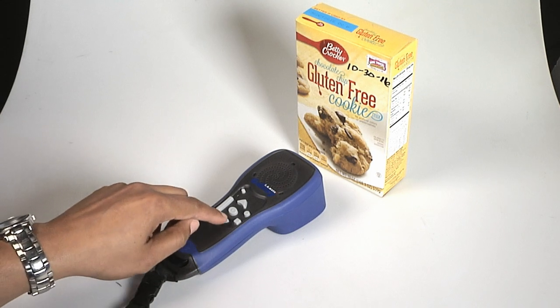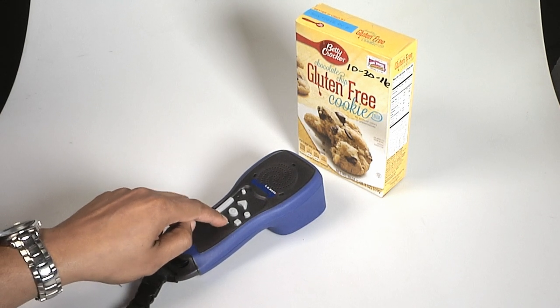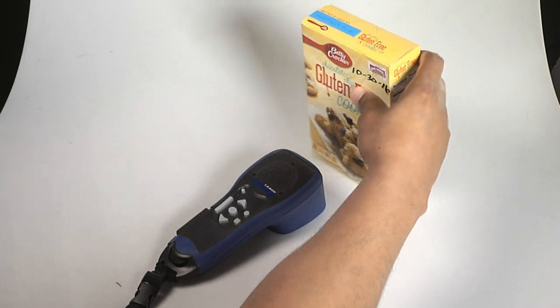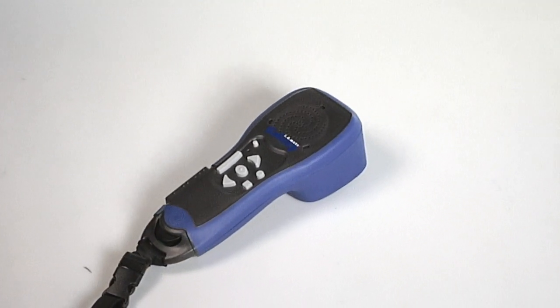After scanning the product, press the next button to hear the package size, instructions, ingredients, serving size, calories, and nutritional information. If you need to repeat any information, press the previous button.